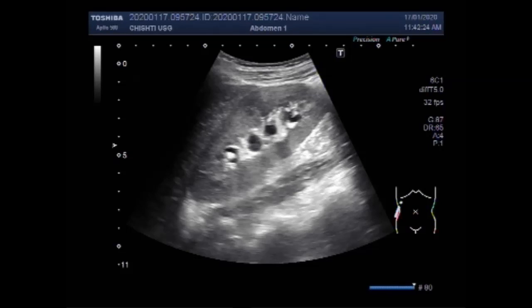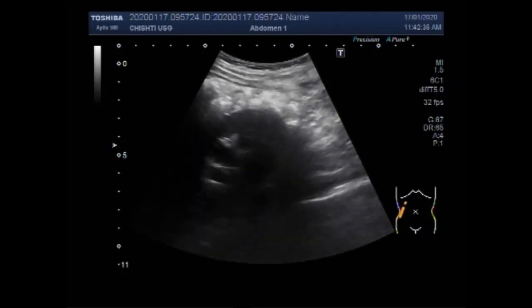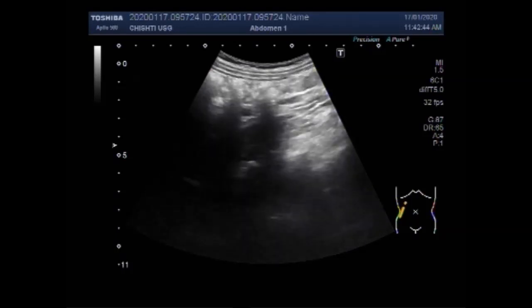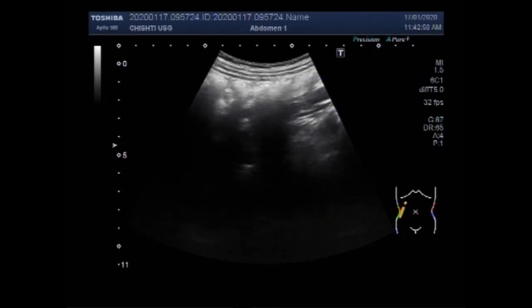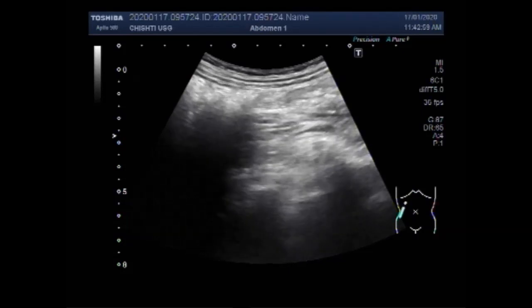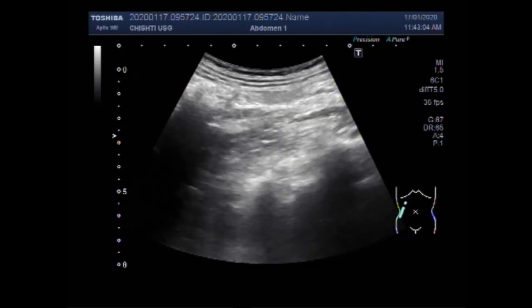There is mild hydronephrosis, and you can imagine that the stone might be small in size, and it may lie in the distal portion of the ureter. Now you can see the upper one third of the right ureter is a bit difficult to focus because the intensity of the hydroureter is less.